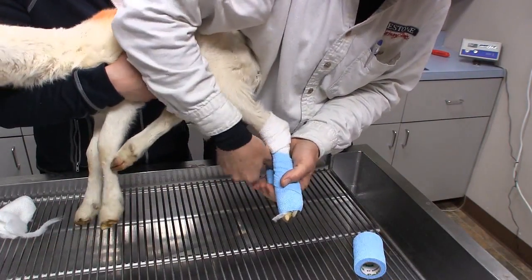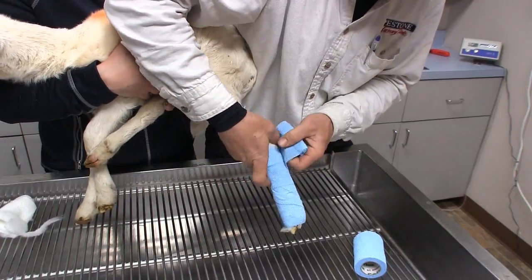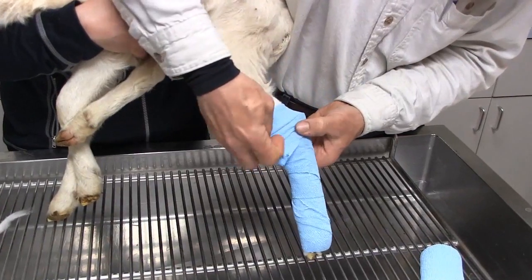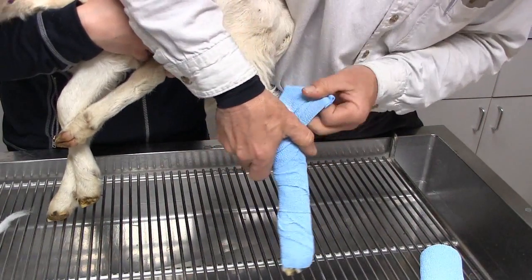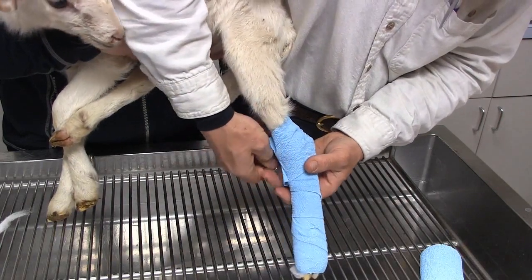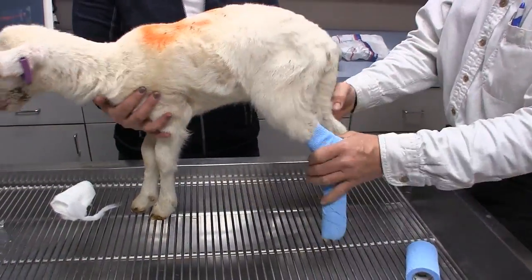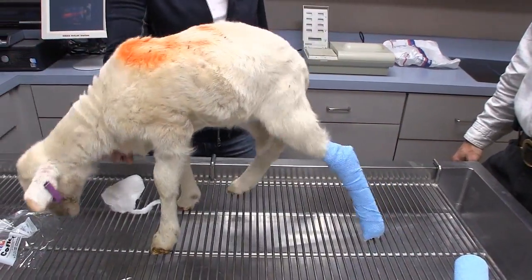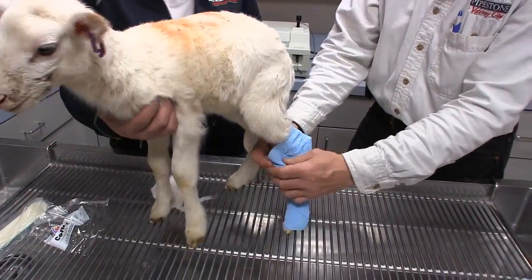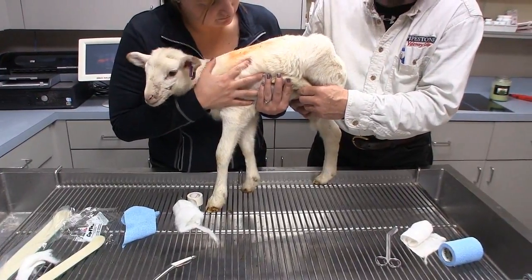Once we get the assistant to hold the lamb close to her body, you can notice that the lamb is much more at ease. So the closer we can hold the lamb to us, the more secure it'll feel. And we want to wrap just above the hock. Again, we want to be able to maybe stick part of our finger above and below it, just so we have some space for swelling. In this case, the lamb, even with a fractured leg, should be able to bear weight on it almost immediately after putting the splint on. Again, leaving the splint on for about 10 days to 2 weeks, and the fracture will be healed.